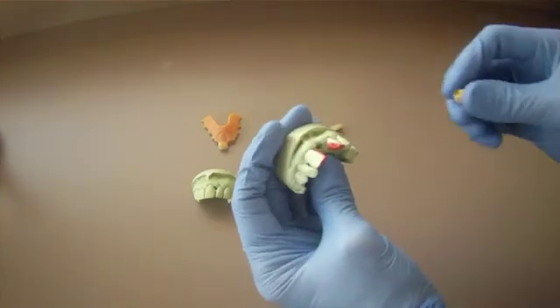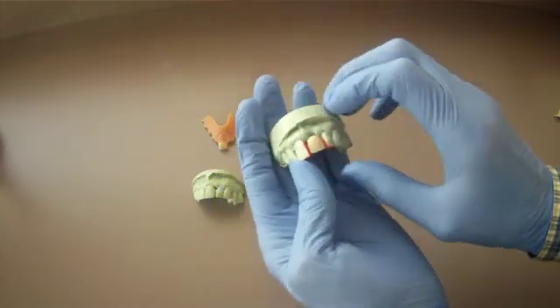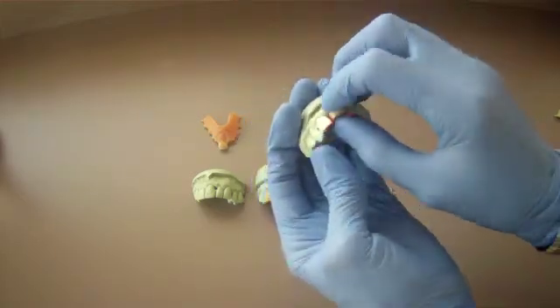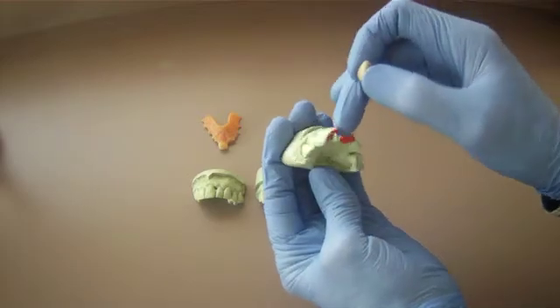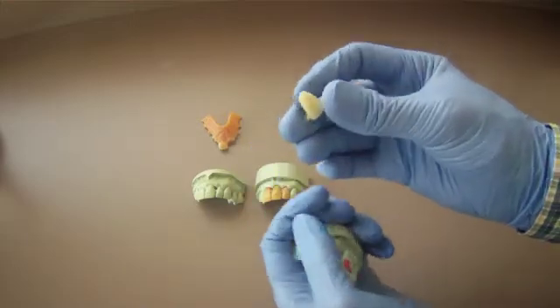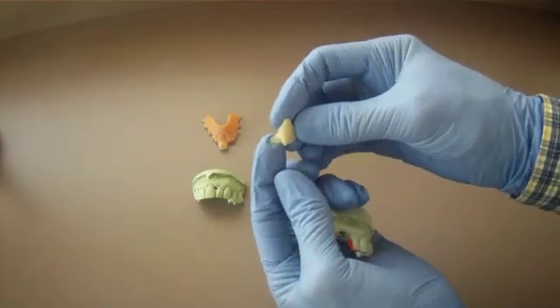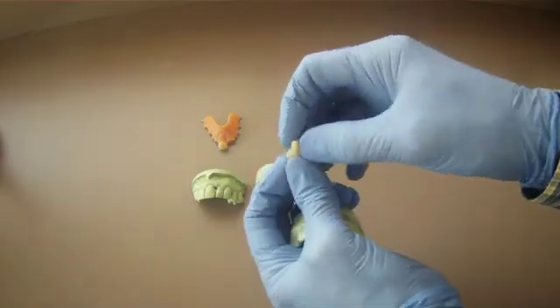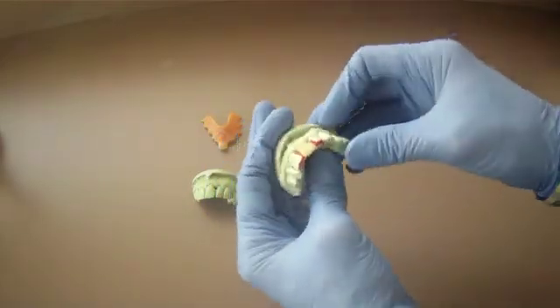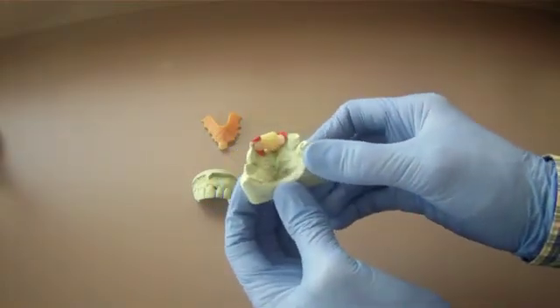The fourth alternative is to take a tooth, or a Wing Pontic we call it, and attach it to the reddened areas. So these are the reddened areas that are outlined. There's no cutting in the Carlson Bridge. This is what we call a Carlson Bridge. It's a Pontic, or what we call the Wing Pontic. And this is what it looks like when it's installed, somewhat like this, but it basically attaches only to the reddened areas. There's no cutting of the tooth, no preparation.